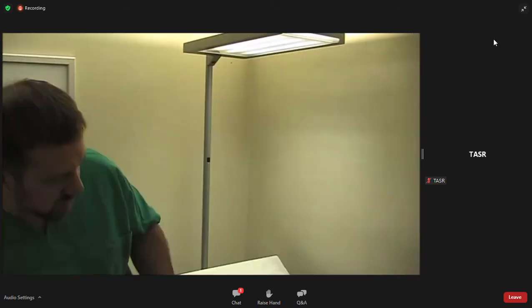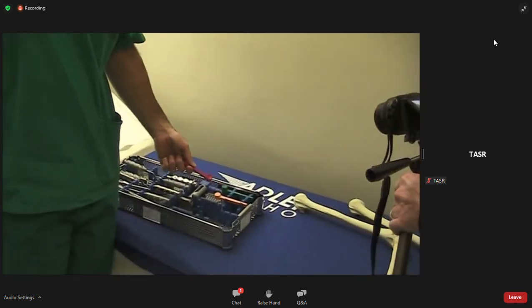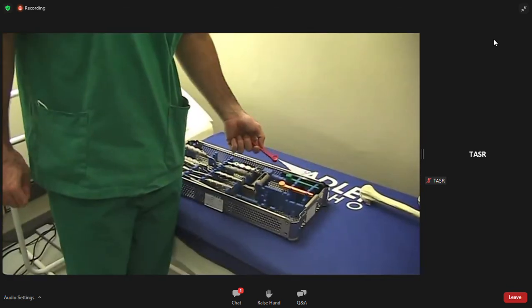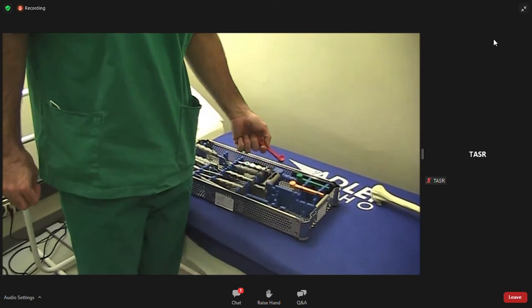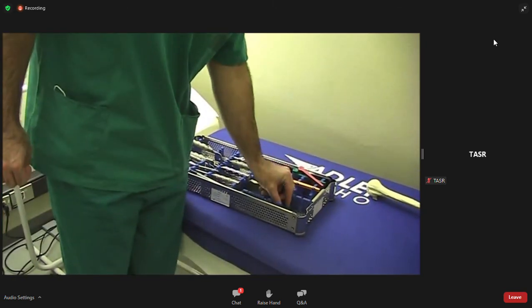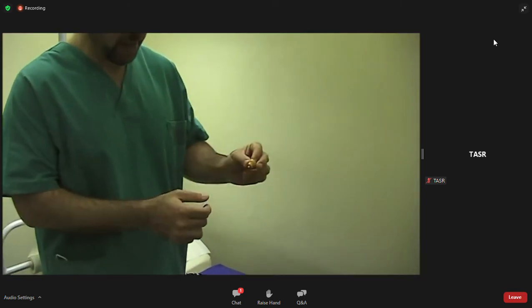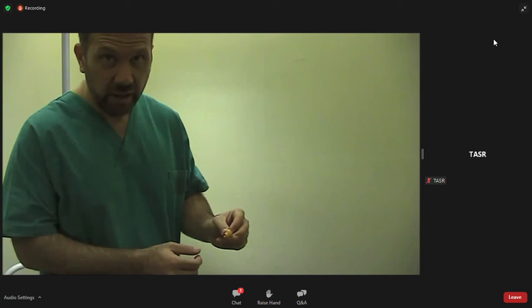Of course, you have 3 sizes. Those are guided by colors, so that you know that changing color, you are increasing the dimension of the prosthesis itself. On the other side, on the stem that is going to be a trial, even in a secondary phase of the procedure, you can add this head that is going to reproduce the final construct.